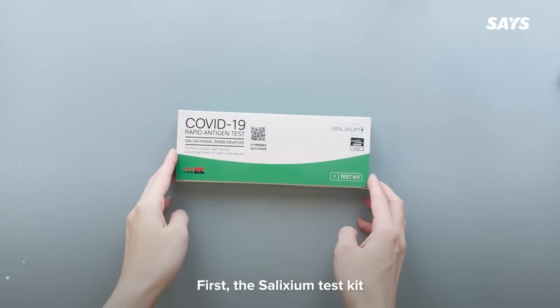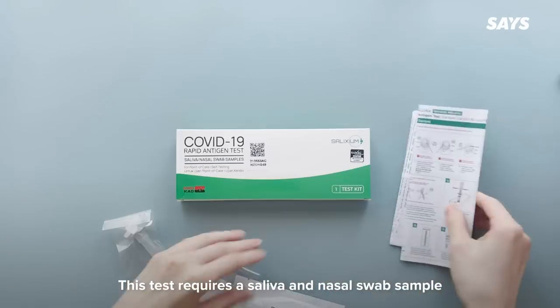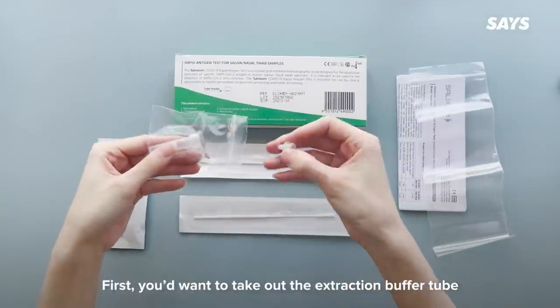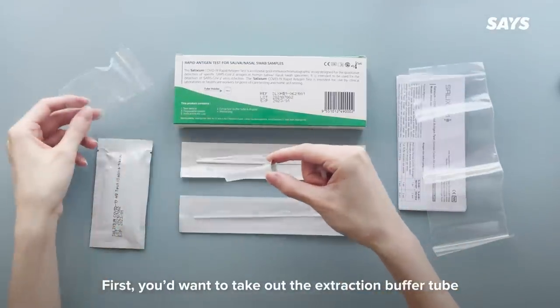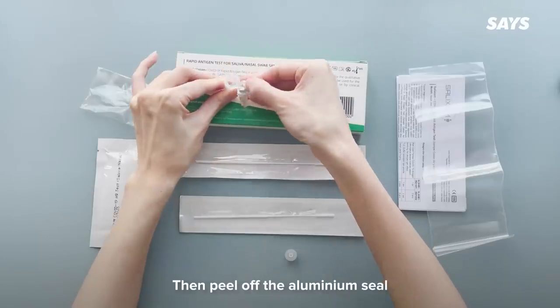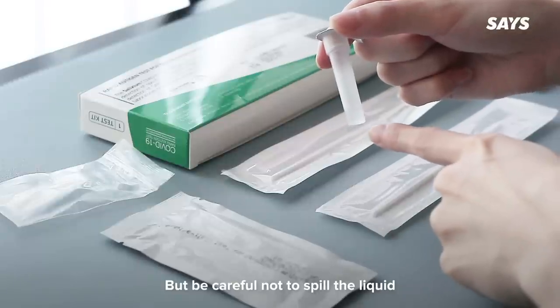First, the Salixium Test Kit. This test requires a saliva and nasal swab sample. Take out the extraction buffer tube and insert it into the tube holder. Then peel off the aluminium seal, but be careful not to spill the liquid.